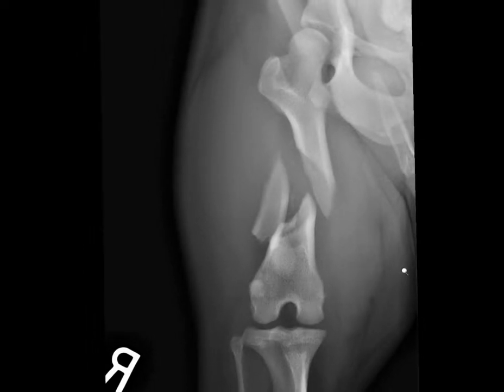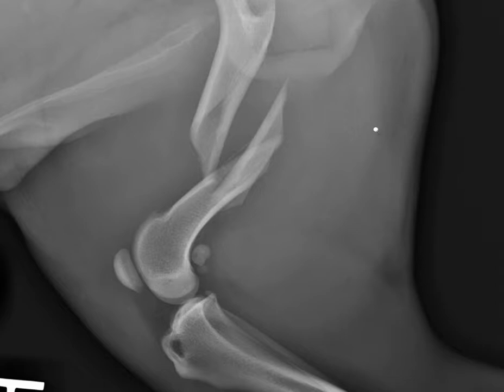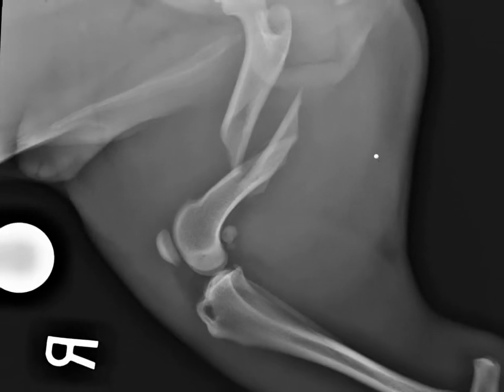Here I'm showing you the craniocaudal view. And here's the lateral view.